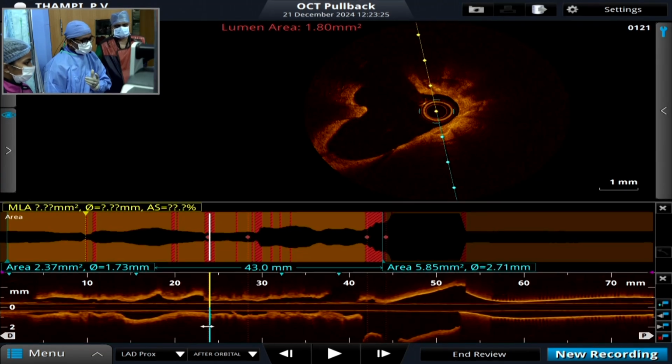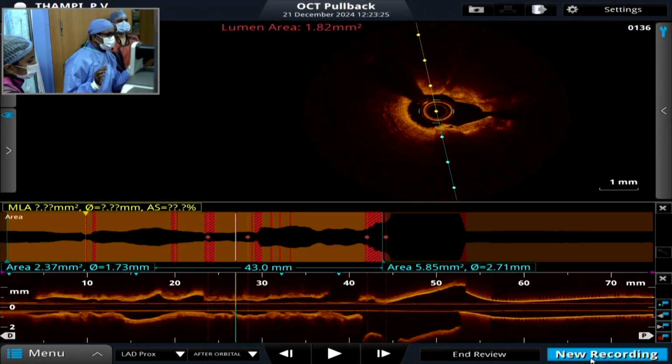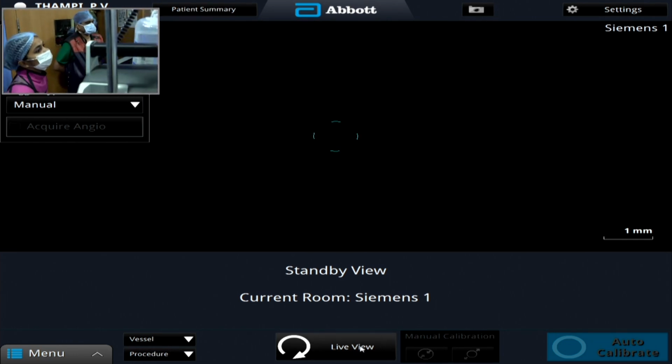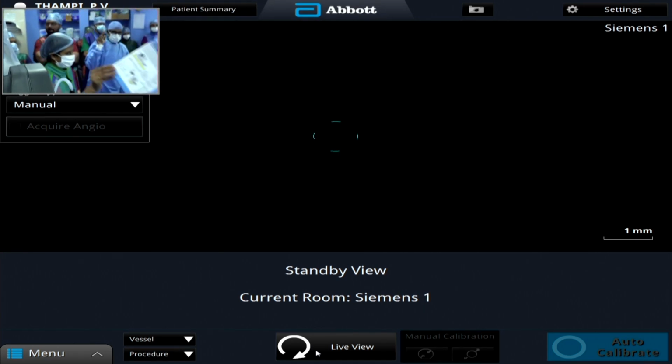So that's it. Now we are doing a repeat OCT, right? Isn't it, Sini? Ready, sir. Okay. Now be ready with the stent also, 2.5 by 48. Right. Yeah.